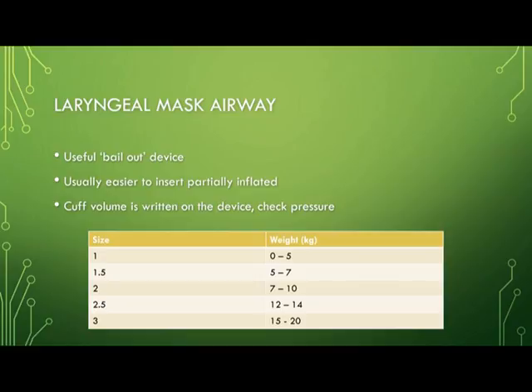The volume of air required to inflate the cuff is also written on the device, but care should be taken once inflated to check the pressure using a suitable pressure gauge to avoid damage to the airway tissues.